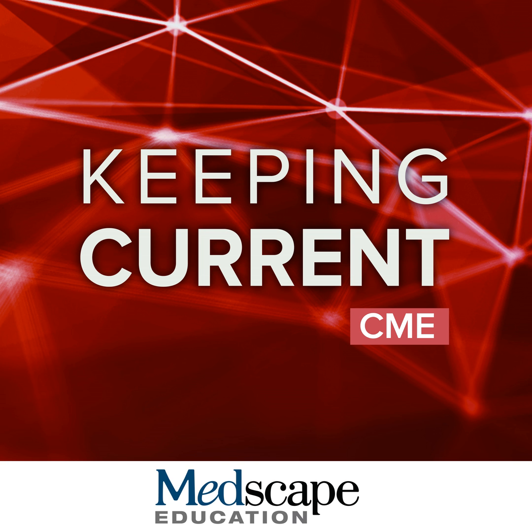Here, though, what I'm showing you is actually a T2 map. It's important that you think about this in your protocol appropriately, because these need to be acquired before you give gadolinium-based contrast. So in that very abbreviated protocol where you talked about injecting gadolinium-based contrast very early on, this would be one of the reasons that you want to do your T2-based imaging before you give contrast, of course.